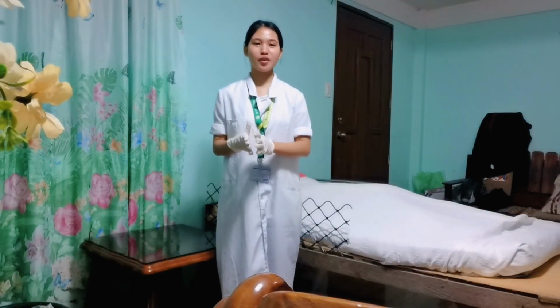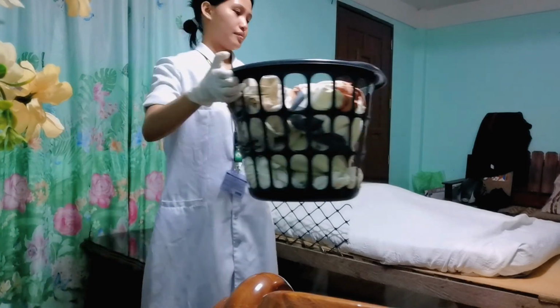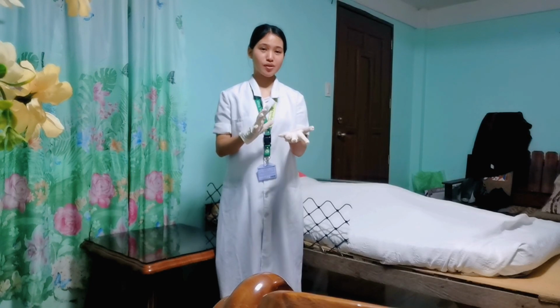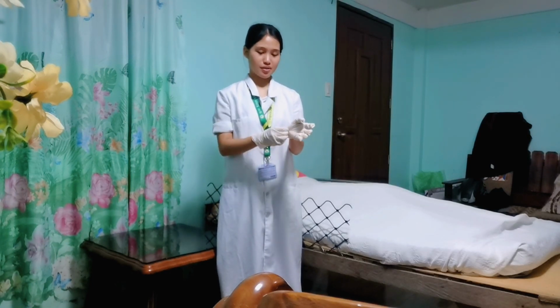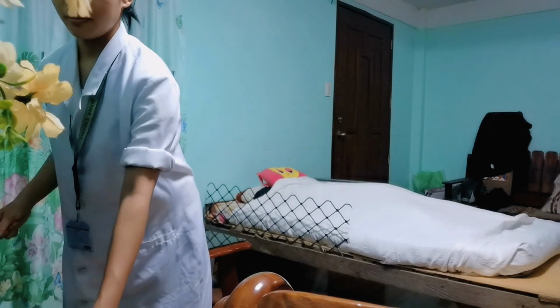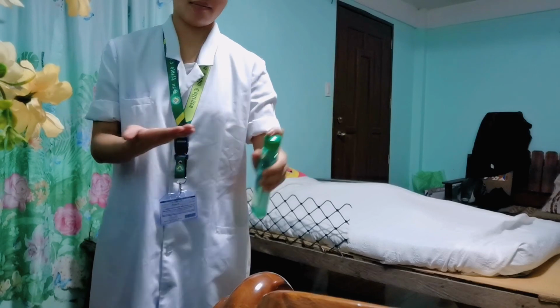In changing an occupied bed, the bed making is not usually recorded. So now we are going to dispose the linen barrel or hamper with the soiled linen in it. After that, remove the gloves and dispose of them, and apply hand hygiene.